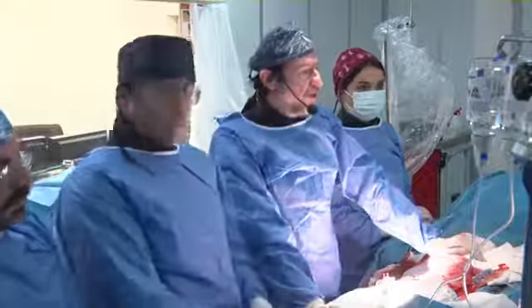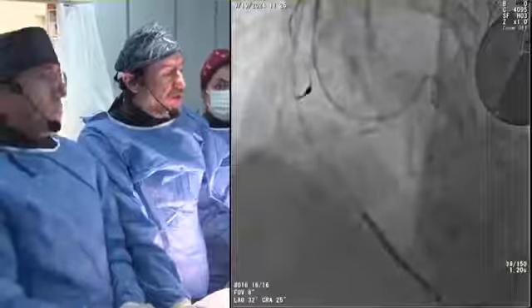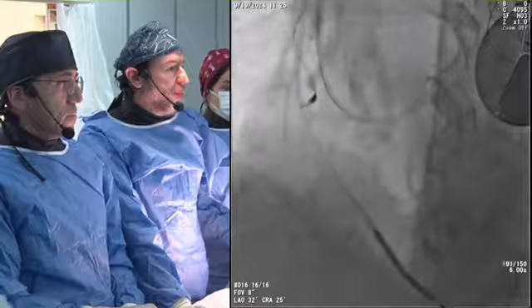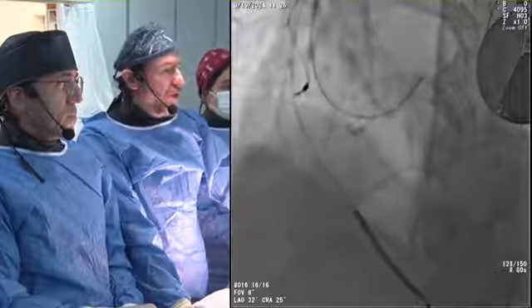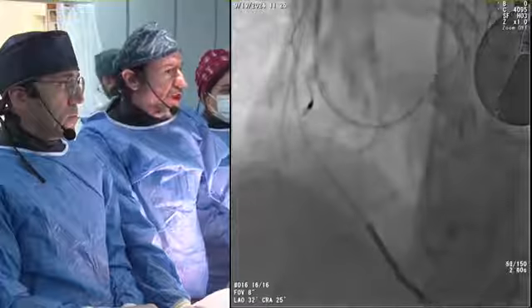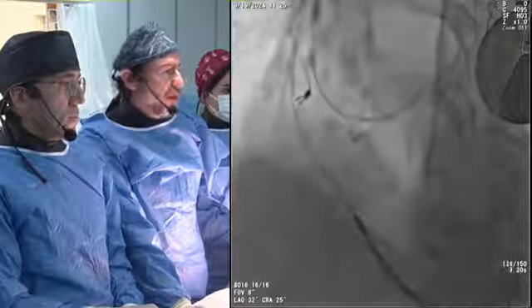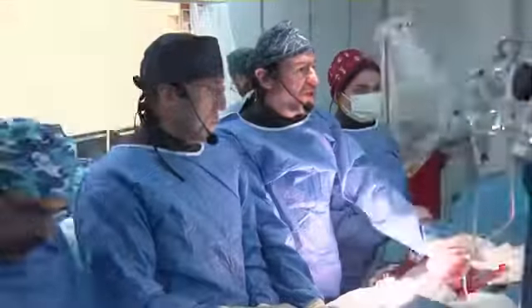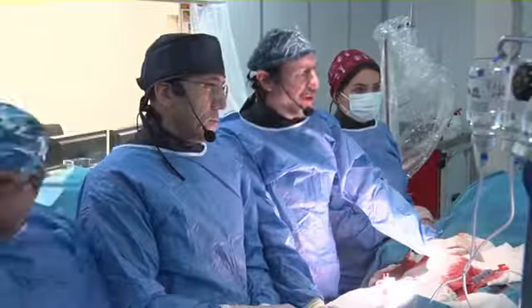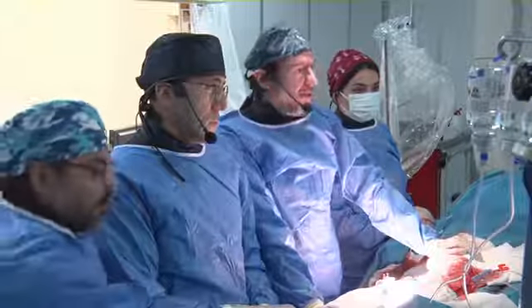We have a CT angio, but the CT angio doesn't help us much. We also have creatinine problems. This patient has renal failure. The creatinine levels are under control now, and until now we only used 50 cc contrast. We tried to engage antegradely at least to see the ostium of the RCA, but we couldn't see it clearly. There is maybe some channel, but the engagement is very poor. We don't have any engagement there, and the CT doesn't help us much at that point.